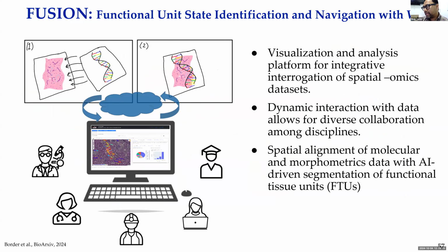You can go there. We are recruiting users. We have more than 100 users of this tool. This is one example. You have a histology sample. The tool shows you the cellular abundance, spatially, with respect to histology. And not only does it do that, it also does quantitative analysis. It shows the cell composition for different structures and different regions.